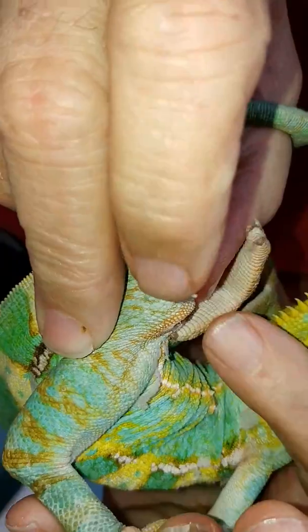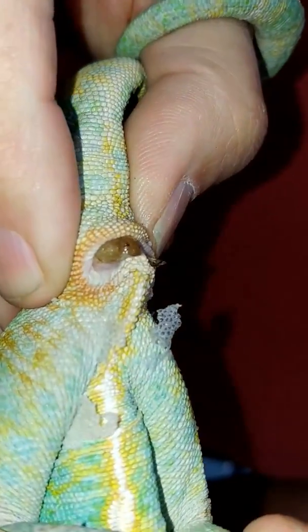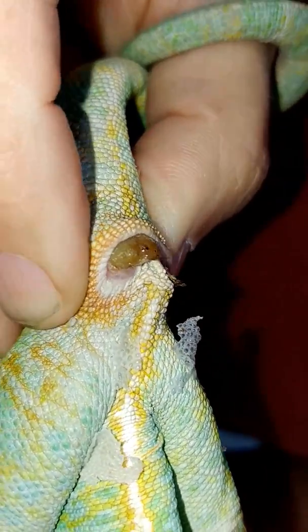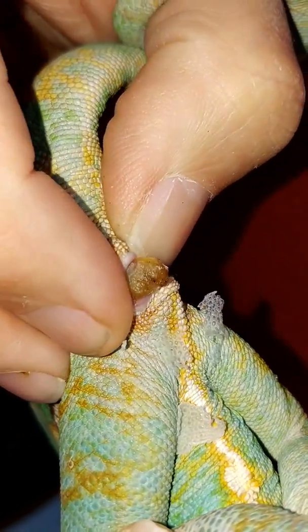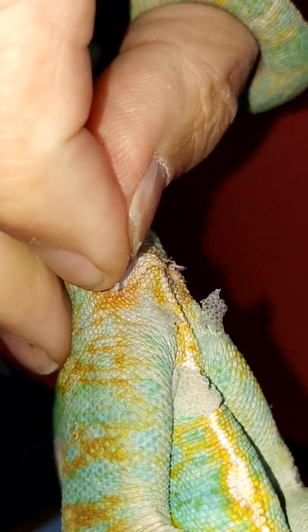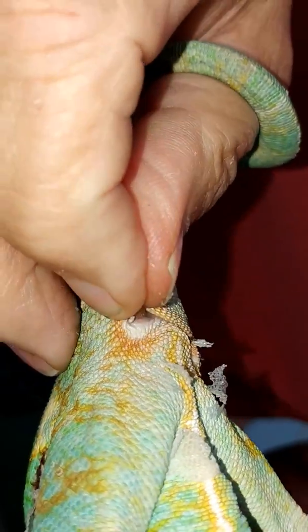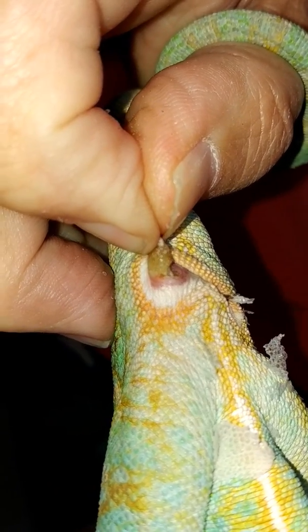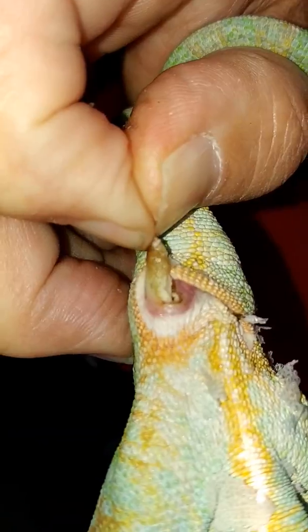Hold on with this foot — no, you can't grab that one. Here, grab that one. There we go. Just gentle, trying to get gentle traction there.